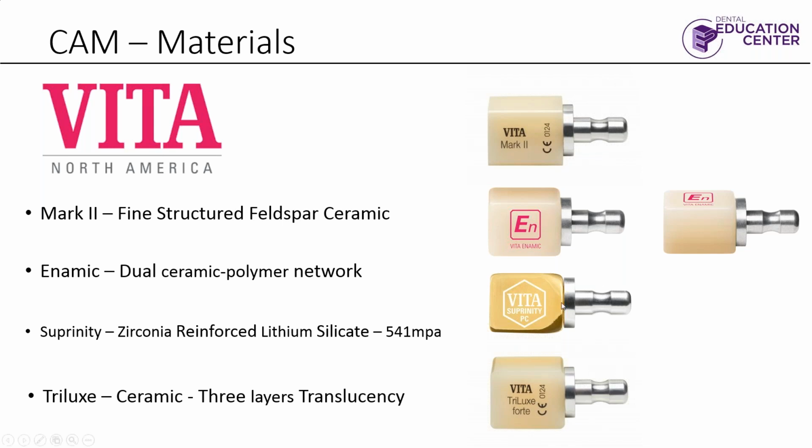Sorry, I just lost my train of thought. The Suprinity is a silicate, but it's reinforced with zirconia, so it's a little stronger. And again, Dr. Schenk, if you have any uses of these materials, if you've used them, some of your favorites, I'd love to hear it.